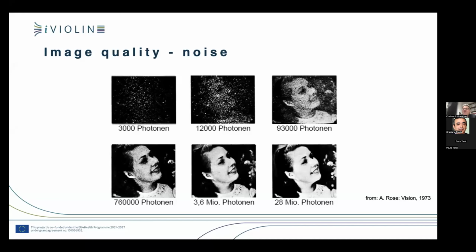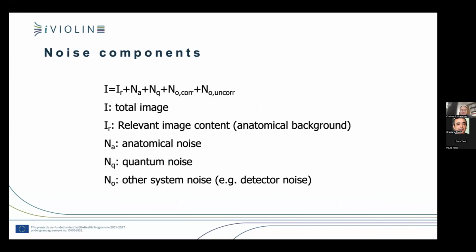Nevertheless, you see that there are quite some interesting challenges if you talk about the noise in an image and the relation to image quality. I'm referring to that with that much detail because you really see that the question, which image quality is appropriate for diagnosis, will depend on the single case.